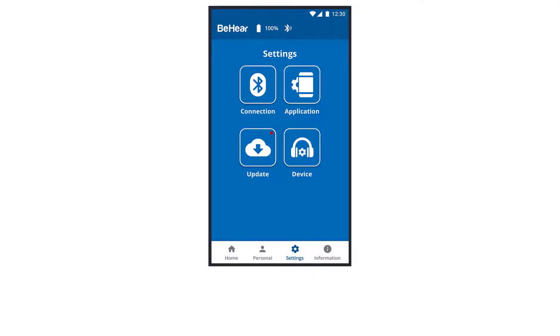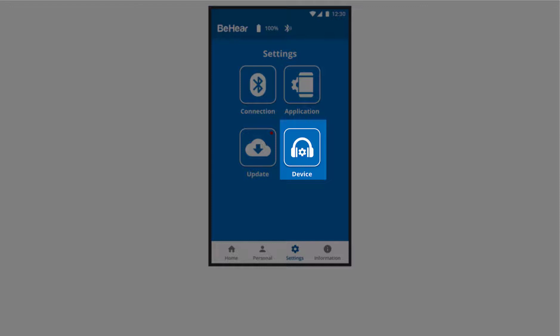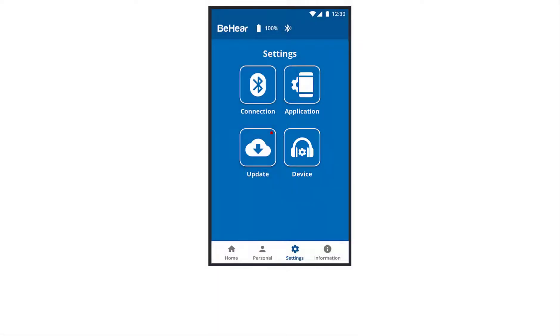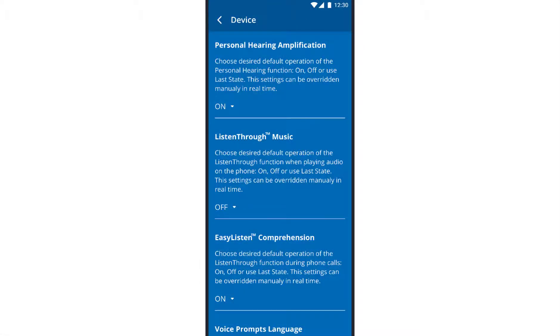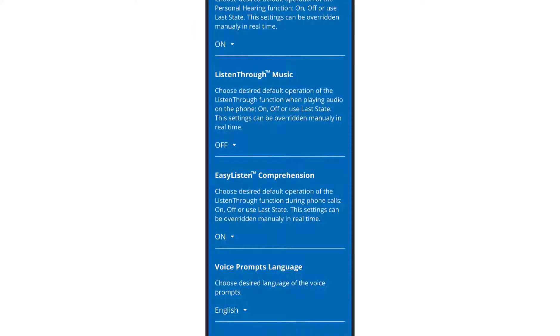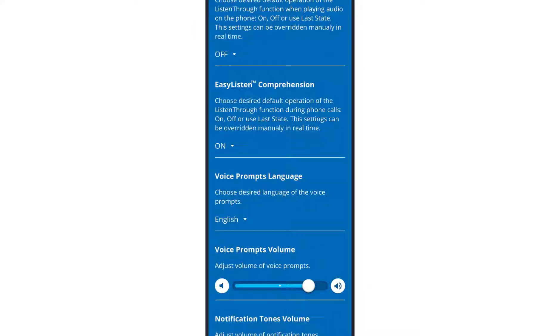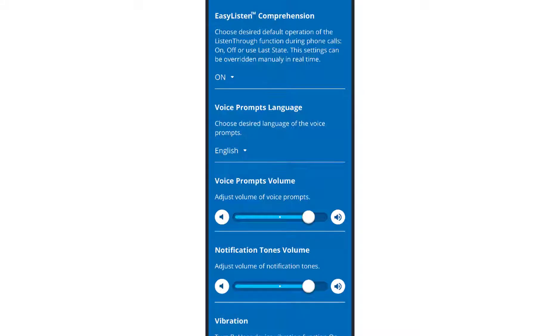The device section lets you determine your default preferences for headset behaviors, such as in which mode to start each hearing mode: personal hearing, listen through for streamed audio, and easy listen for phone calls. For each of the three modes, you can choose between on, off, or according to the last state.